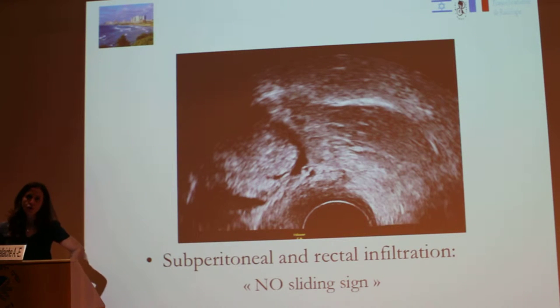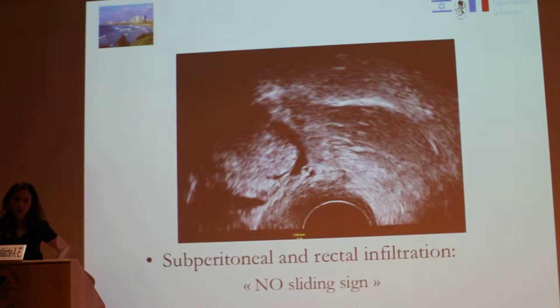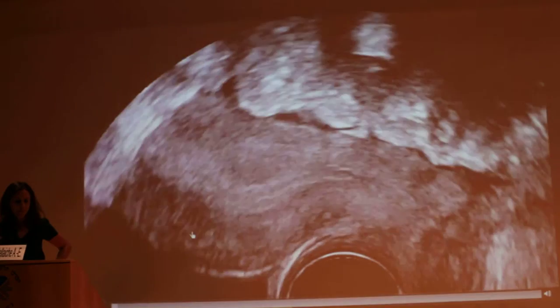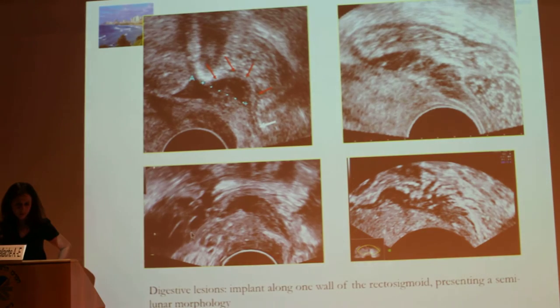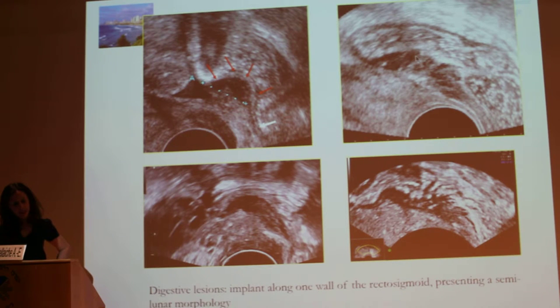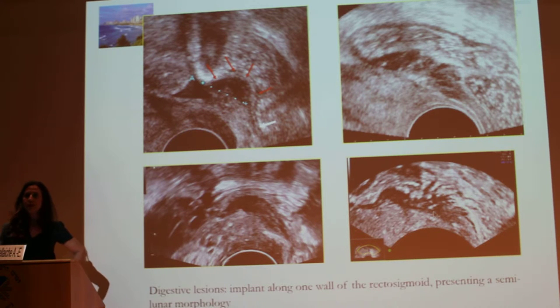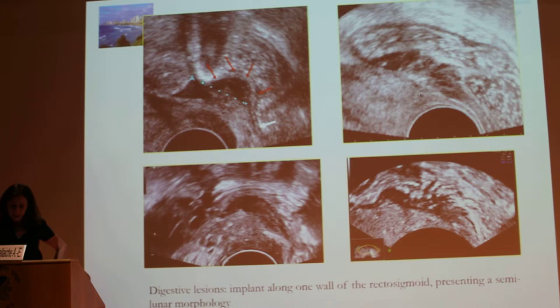It is important to recognize the sliding sign — it means that there are no adhesions. Here you have an example of rectal involvement with ultrasound. It is implanted along one wall of the rectosigmoid presenting a similar morphology with irregular borders. It is quite easy to make the diagnosis with ultrasound because there is a hypoechoic pattern, like you see here.